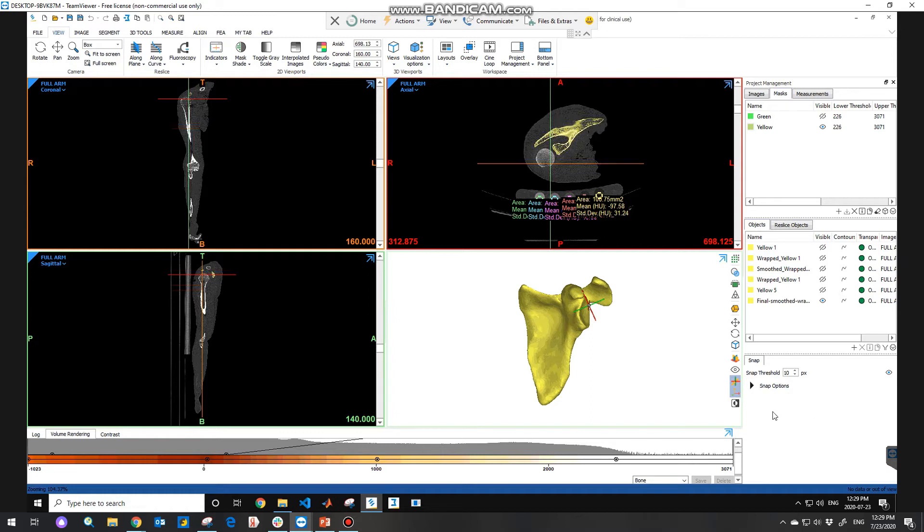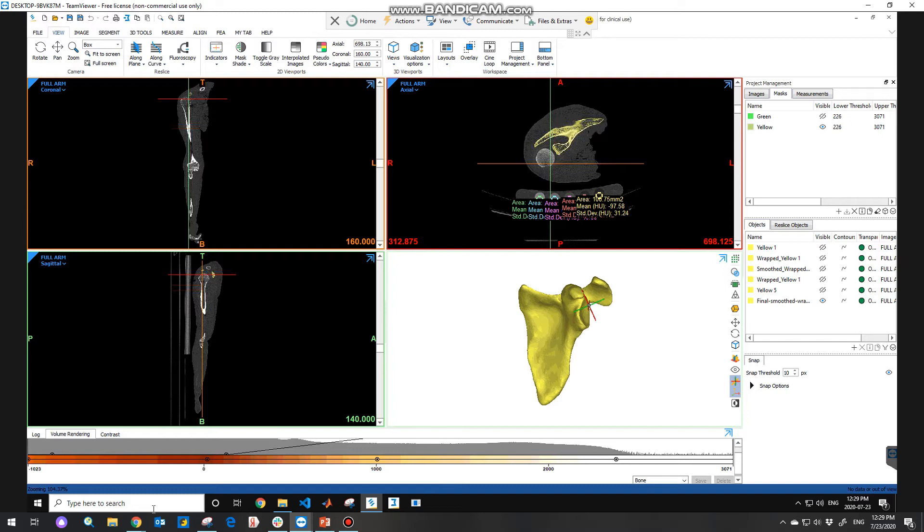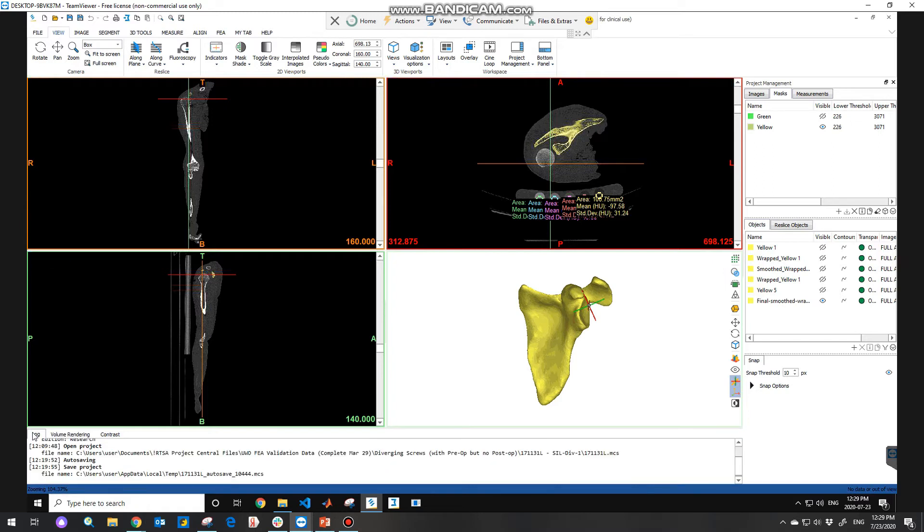And then a finite elements method tab, FEM tab, will appear here. Then you can apply material properties on the model which I've already showed you in a previous video I made. At the bottom of the GUI, you can see the logger which keeps track of all the actions we perform.